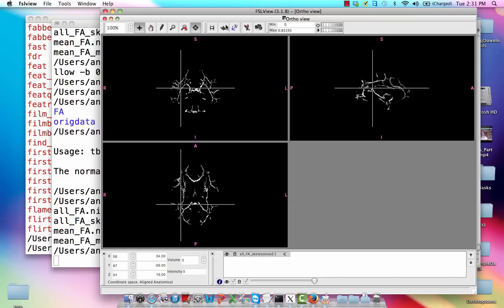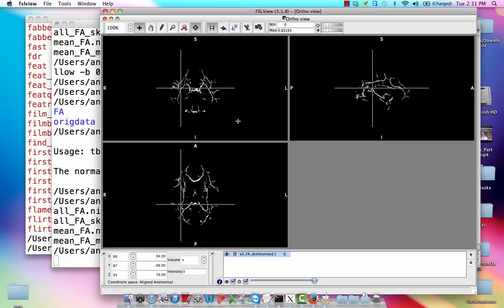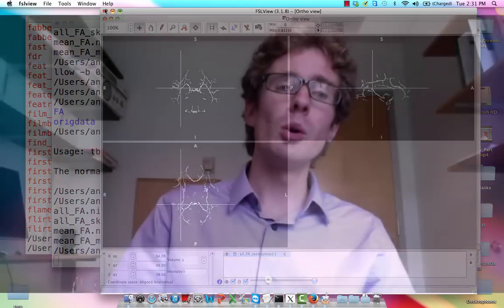So if we turn that on again, this is just another way that you can look at each subject. If you have a lot of people, that beats just clicking on each of them individually.